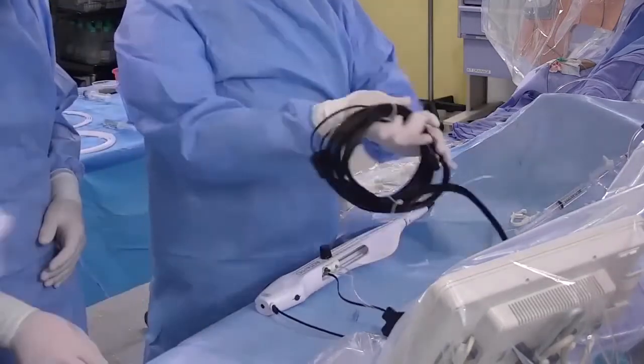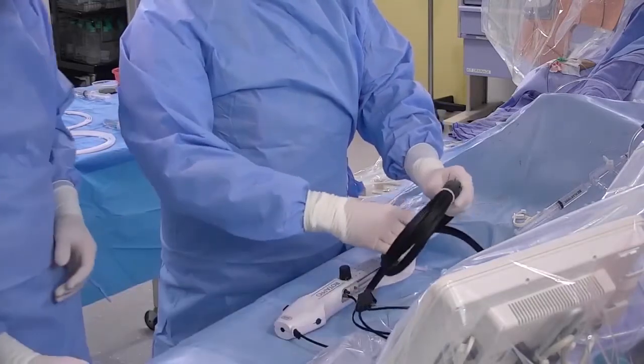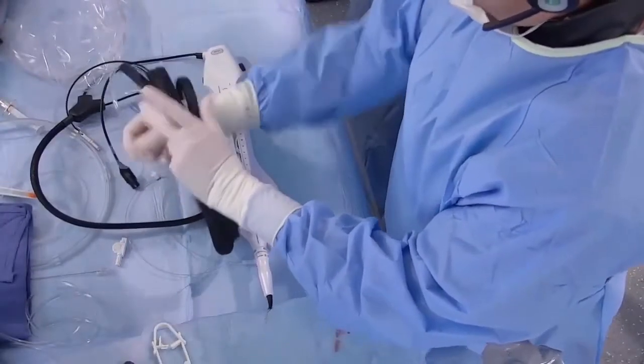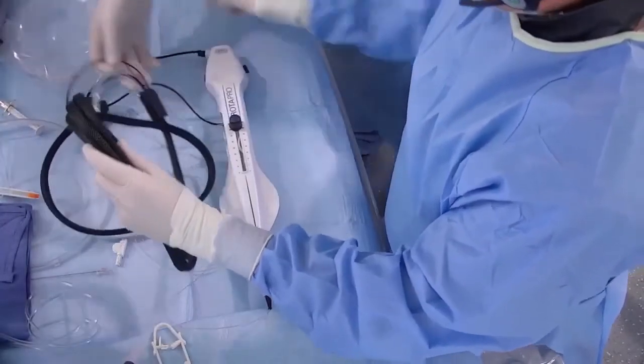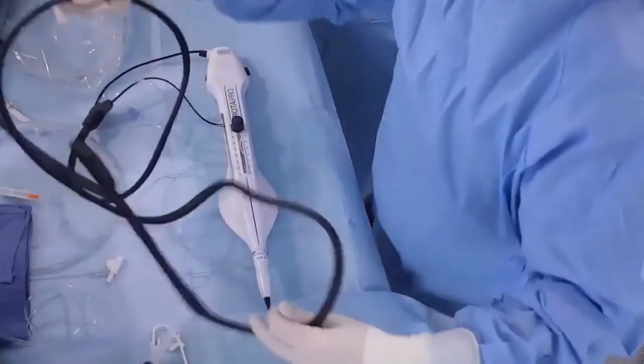This part is quite huge, and you have to place it in the right way to ease the way to use this.